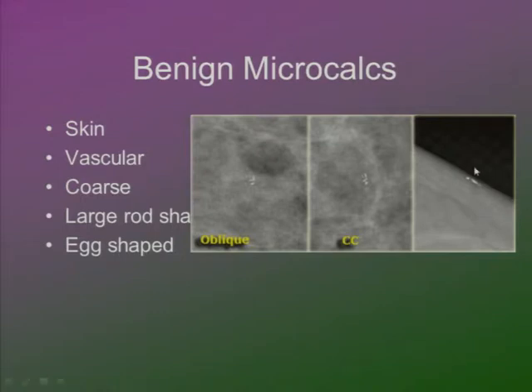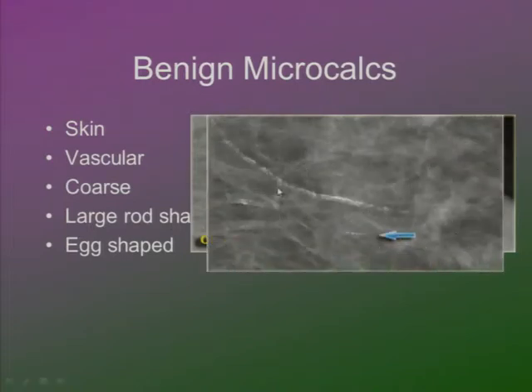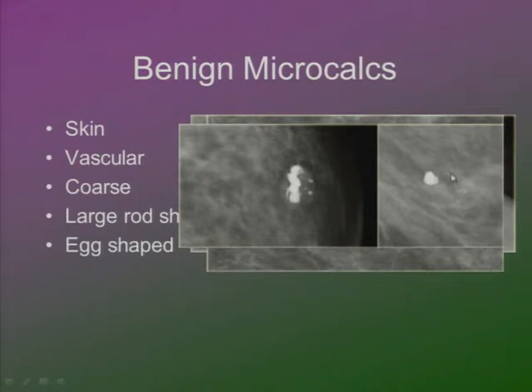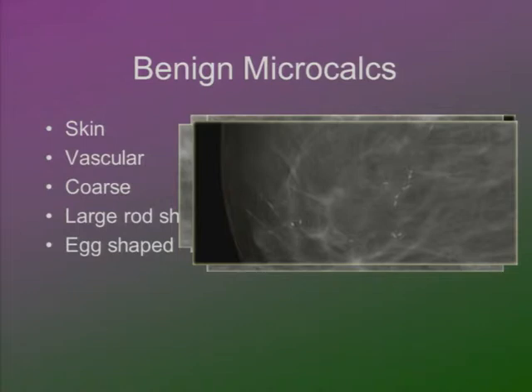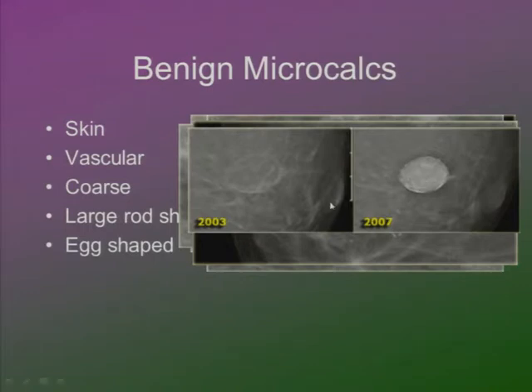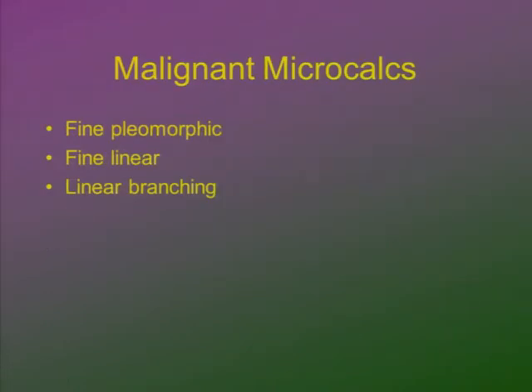With a very superficial tangential view you can see skin calcifications close to the skin. Vascular calcifications follow the anatomy of the vessel — you can trace the track of the vessel in mammography. Coarse or popcorn-like calcifications are usually from degenerated fibroadenomas. Large rod-like calcifications are seen in mastitis, and the eggshell type is seen in fat cysts, fat necrosis, or oily cysts.